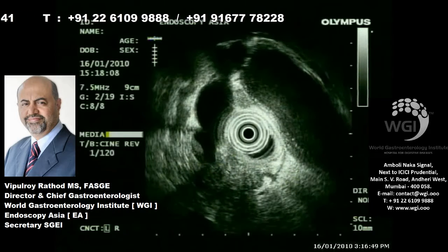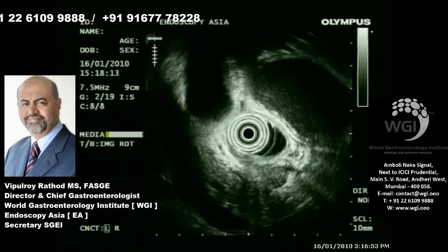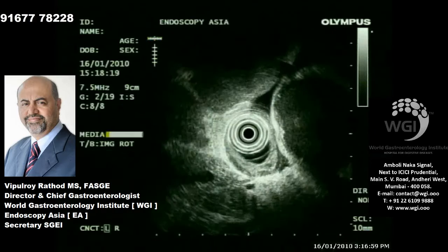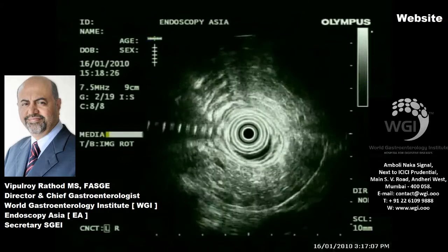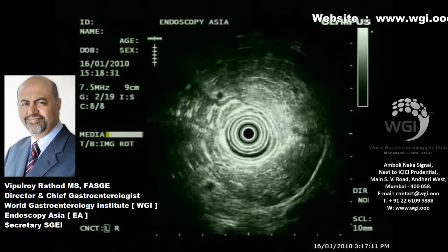Of course, it can be debated whether we always need to do an EUS-FNA of the small pocket of fluid. But when we know that these patients are highly comorbid, and for definitive palliation, diagnosis and staging, it does not really matter. You can see the mildly prominent pancreatic duct here in the body of the pancreas.